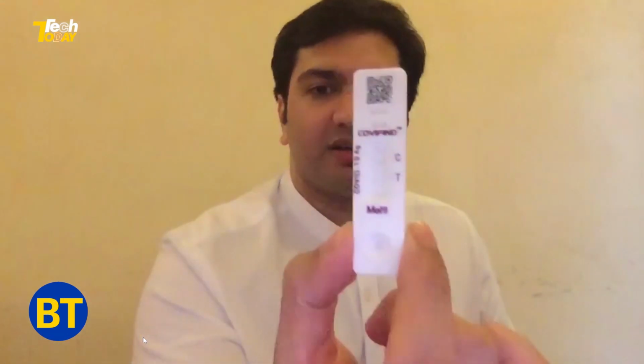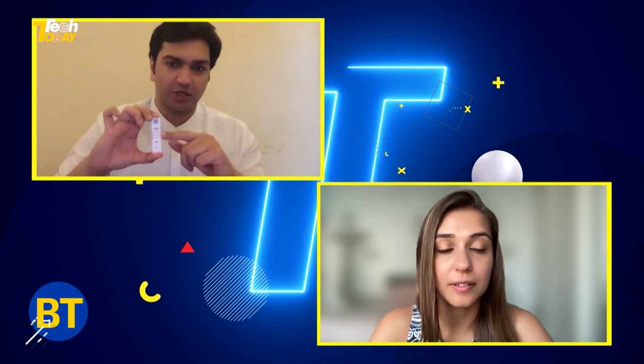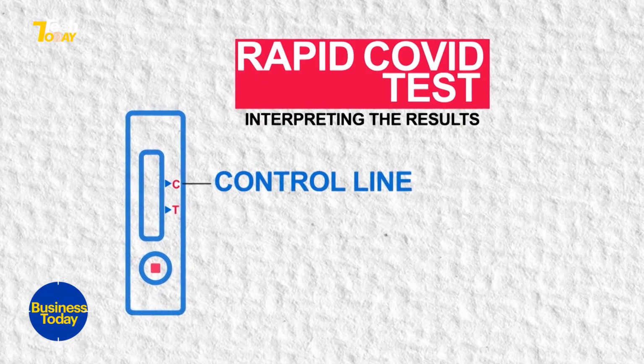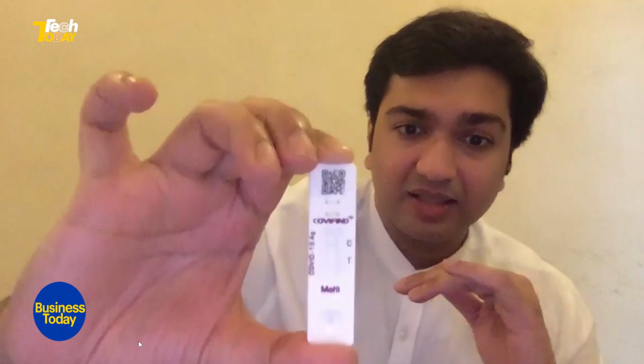So I'm going to open the test now, tear the aluminum foil, and this is the rapid antigen test. So there's a C line, which is the control line. For the test to be valid, the control line has to change color. And then you'll see below the control line, there's a T line. That's the test line. So if the control line is present and the test line is not present after 15 minutes, that's a negative test. If the control line is present and the test line is present, even if it's a really, really faint line, it's positive.